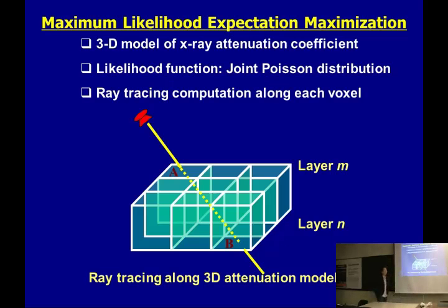So basically for this computation method, there will be a sparse matrix and a lot of computation for each projection line. It will be time-consuming, for example, several hours of computation, because for clinical medical imaging applications, time is a concern for each patient. So there is a lot of work in this field to try to accelerate the calculation, for example using parallel computing or sparse matrices, and other approaches.